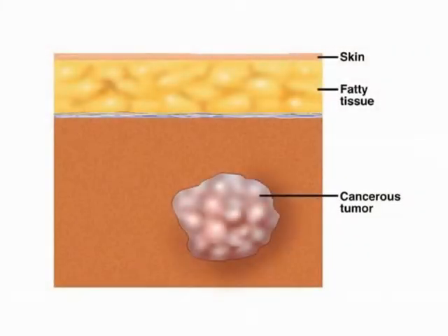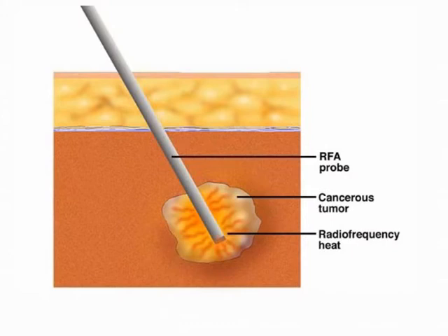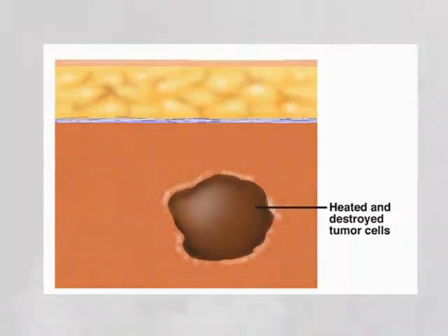What is radiofrequency ablation? RF ablation uses heat energy, or RF energy, that is converted to heat energy and destroys the tumor by essentially burning it out. High temperatures are reached within the tumor, but the surrounding tissue, the normal organ, is protected from this. The way RF ablation is done is through what's known as a percutaneous approach. A small needle is placed directly into the tumor, and then it's connected to the RF energy generator. Heat is applied to the tumor via this needle.